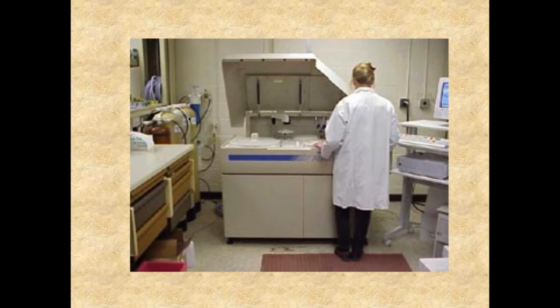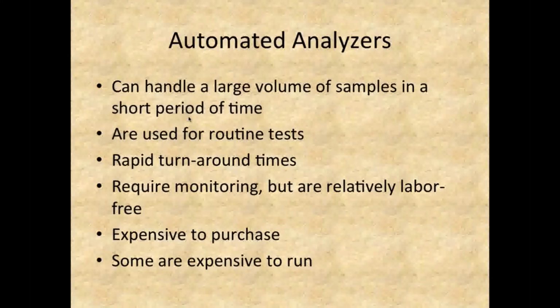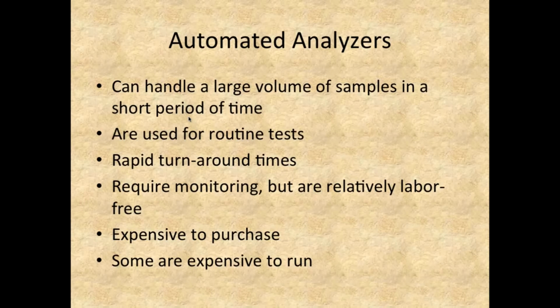Another view of a large automated analyzer is here. This technologist is loading things in. On top we have this big lid that comes down on top of it while it's running, and the clinical laboratory scientist then can go do other testing while the instrument is running.